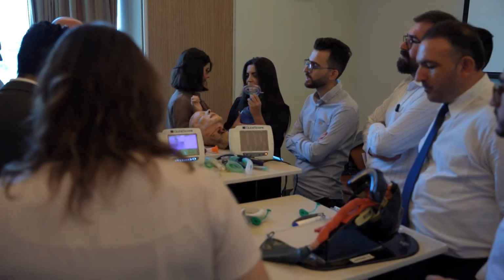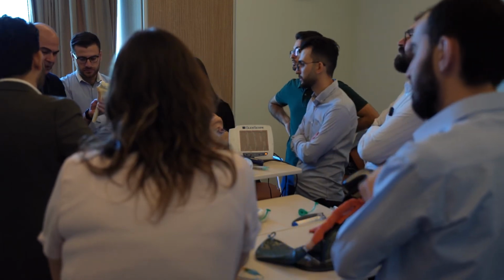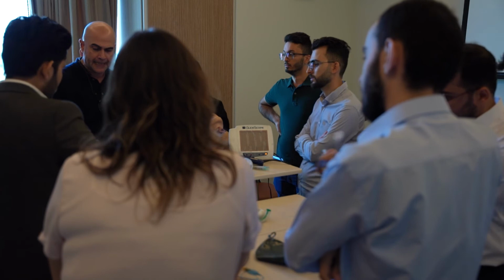The proper way to get intravenous access is through the antecubital line, to put 2 wide short cannulas, and you are going to take blood for sampling, for blood group, for fluid, for drugs, for everything. If you have failed 2, maximum 3 times, the alternative method of choice is just below the knee, at the tibia, in the anteromedial part, 2 fingers from the tibial tuberosity. You are going to select. This is for, let us say, middle-aged or less, 40 kilo, 50 kilo.